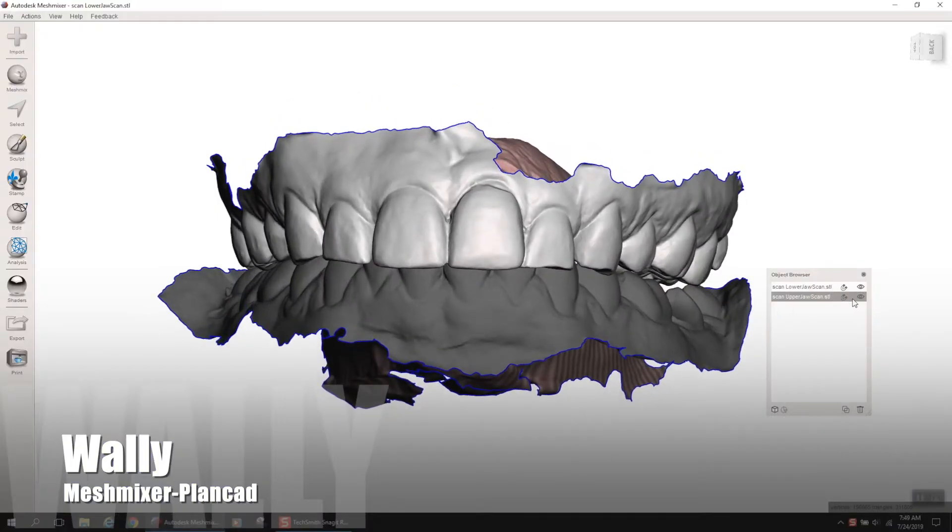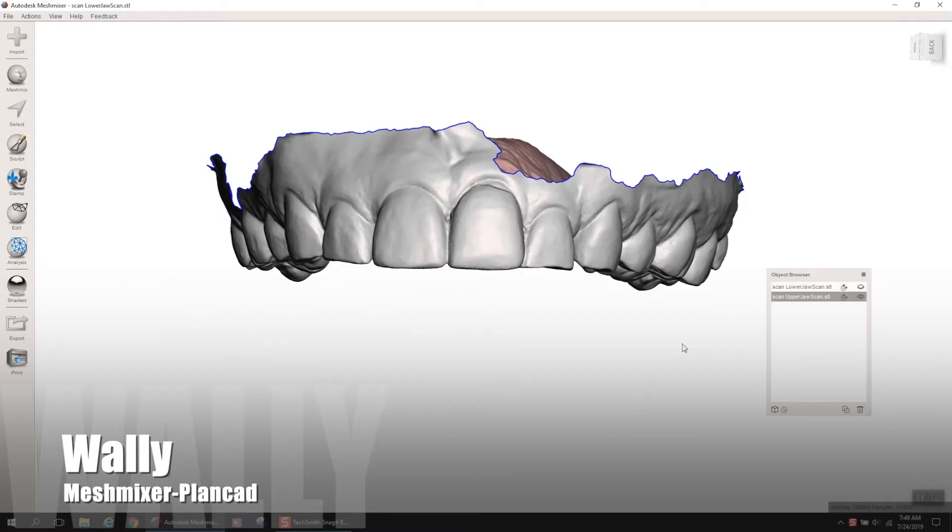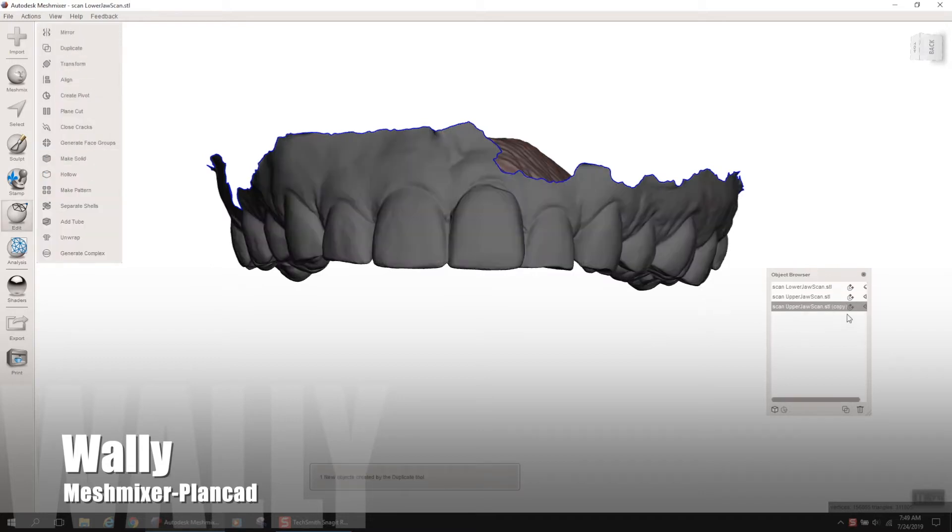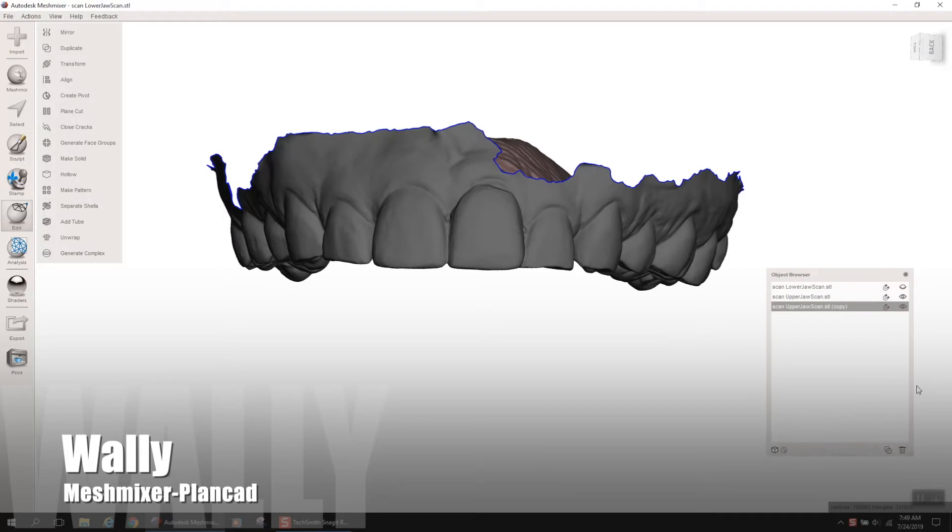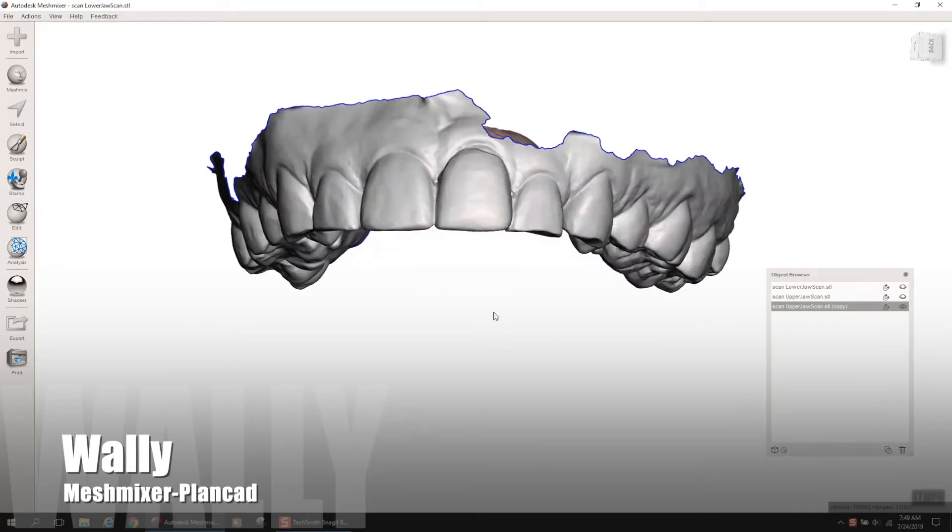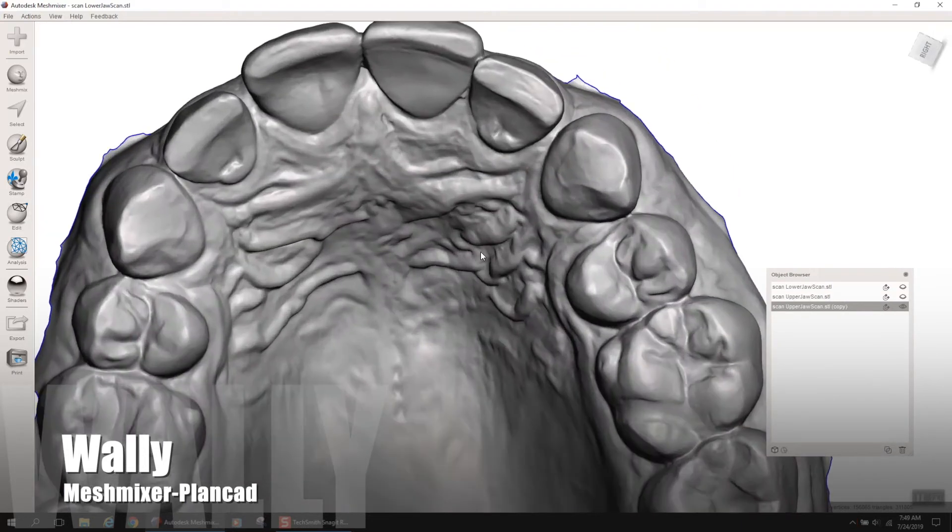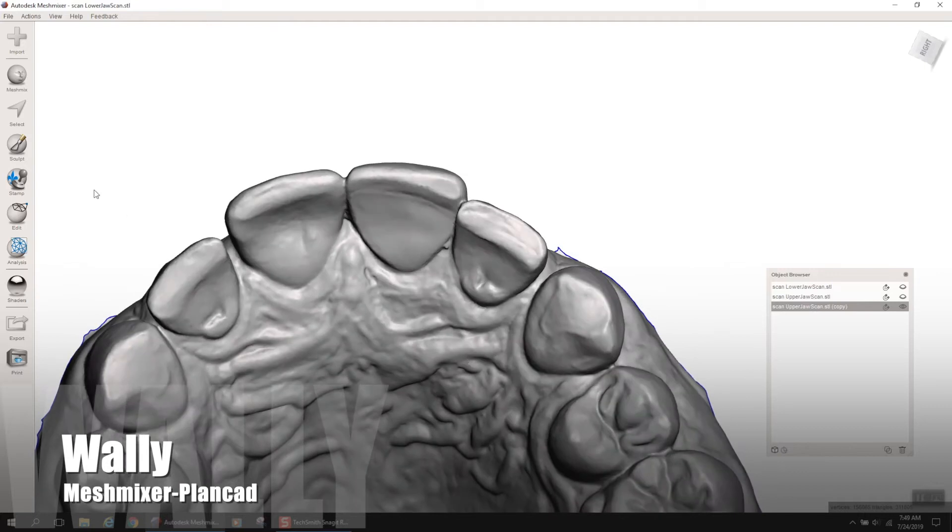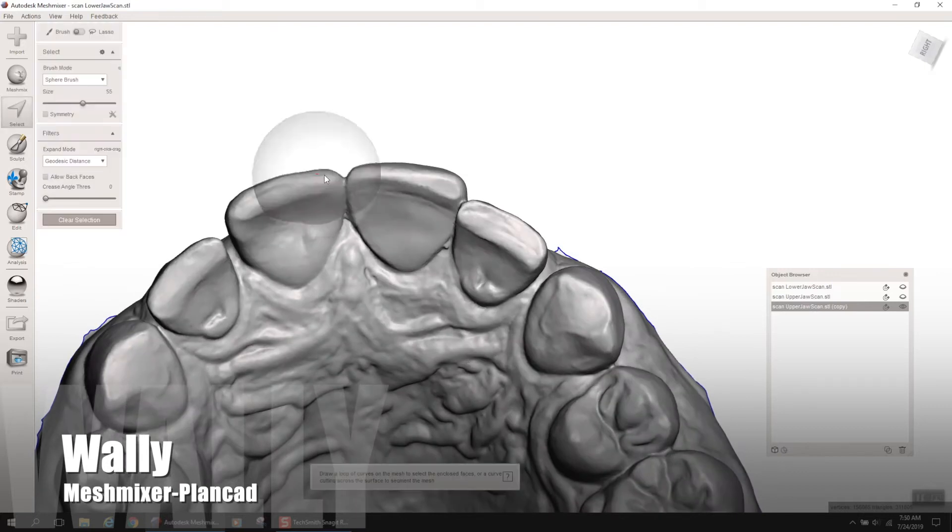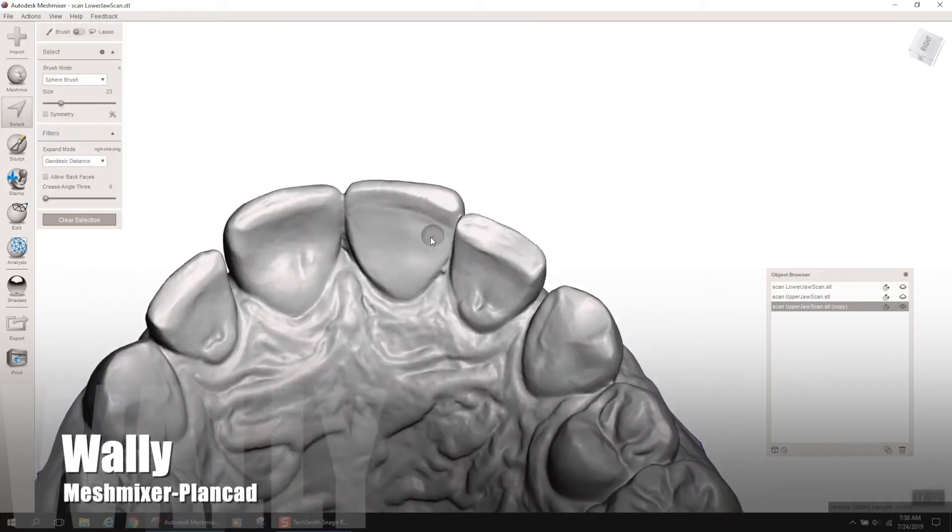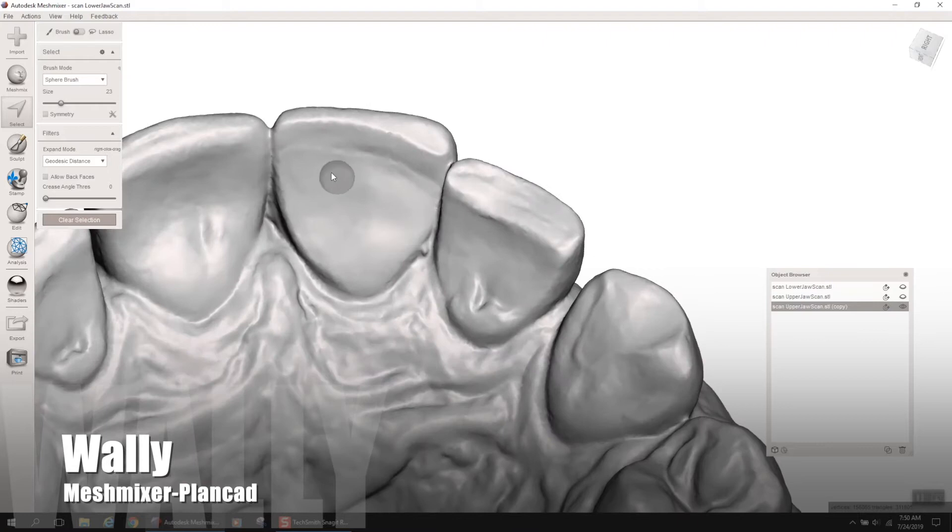So here we have a patient on tooth number 9 that has idiopathic internal resorption of that tooth. It needs to be extracted, and the patient is a diva, does not want anything removable, has a very tight occlusion. I can't hang a wing off the lingual of that tooth number 10 there because of the occlusion. I would have to reduce that tooth pretty heavily.